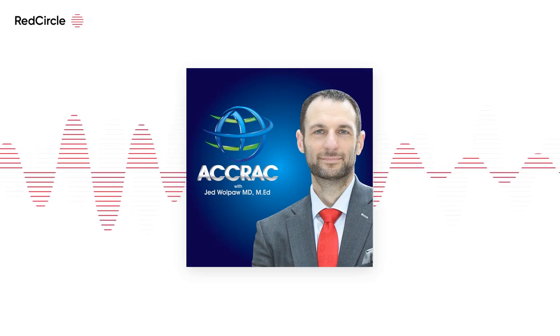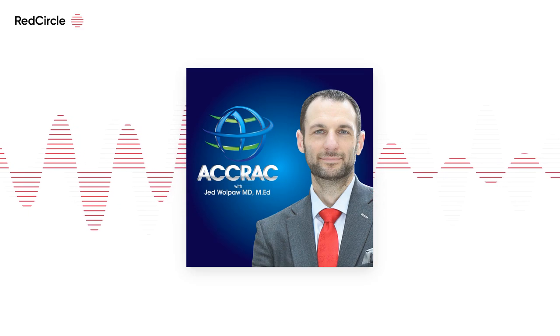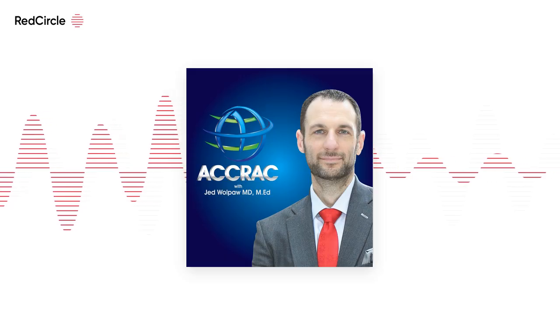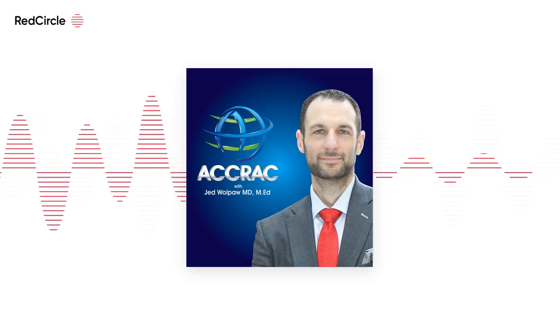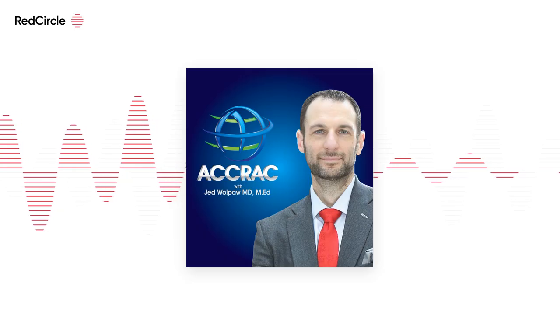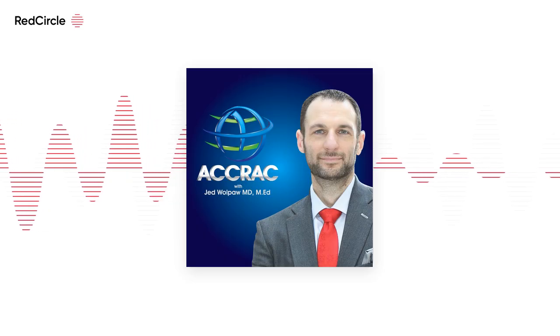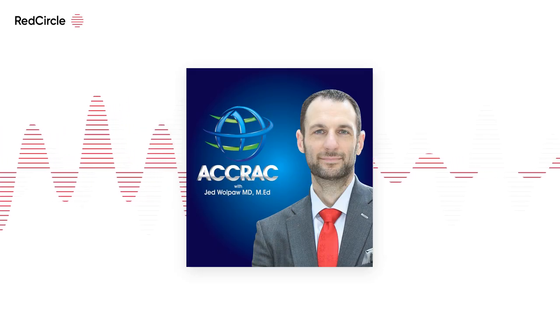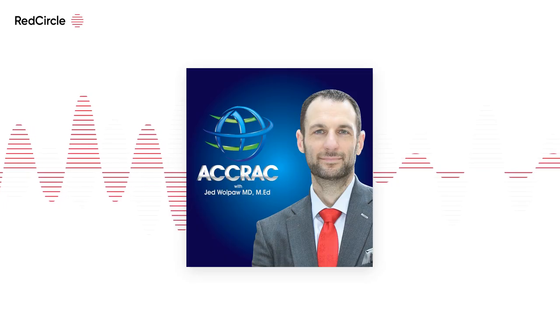So there's likely some underlying injury that could be occurring. So what level of compliance do we choose? Do we choose the best compliance? Do we choose the best +2? And this has been the way that it's been protocolized over the years, doing a decremental PEEP titration. You start at a high PEEP and you monitor respiratory system compliance as you decrease PEEP slowly. This is one PEEP titration method.